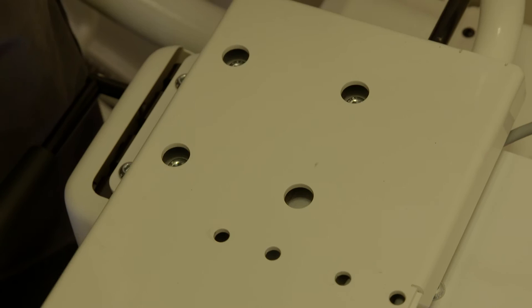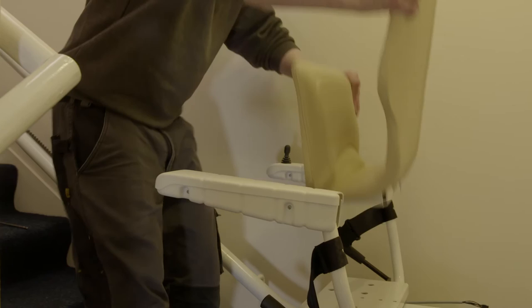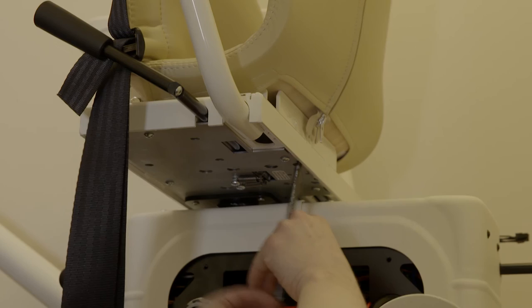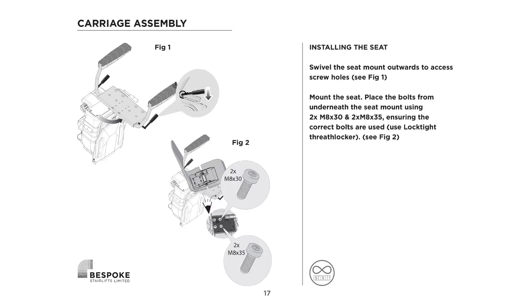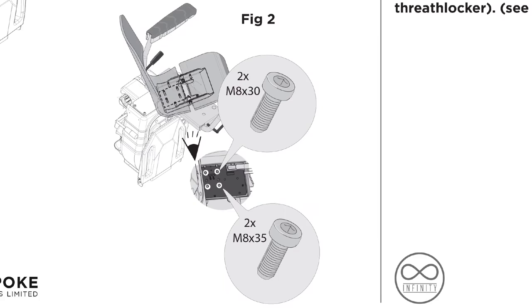Now rotate the seat mount outwards for access to the screw holes underneath. Place the seat in position and fasten using two M8 by 30 and two M8 by 35. It is important to consult your installation manual to make sure the correct screws are in the correct location, again using Loctite on each thread.